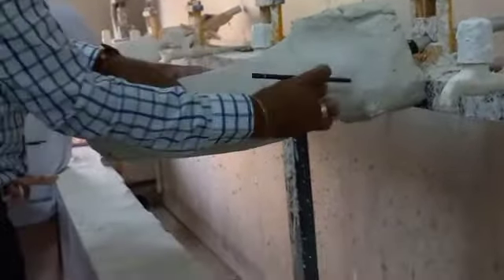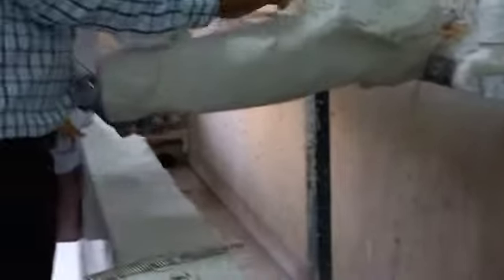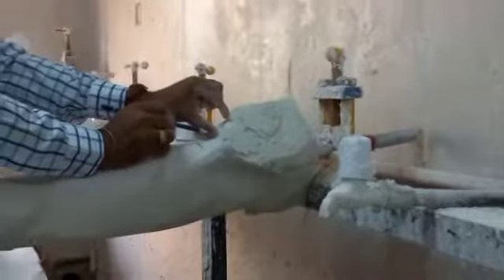So let's say, if this is the lowest, our first measurement, that means circumferential measurement, let's say 4 centimeters, almost this position. So this is our lowest point, let's say. If this is our lowest point, that means the lowest point of the ischium. From there we will be taking all the brim level measurement. So how much containment of the ischium?